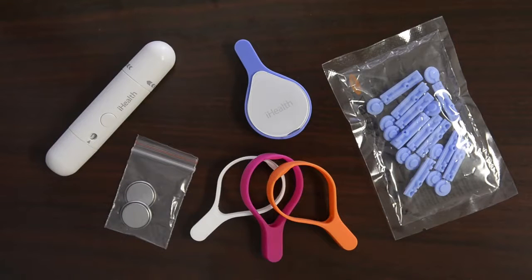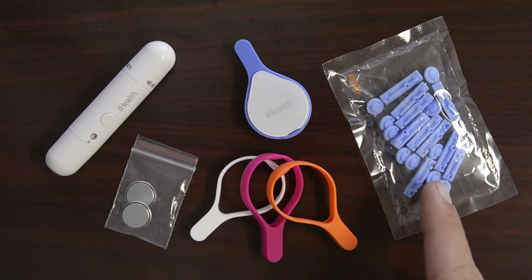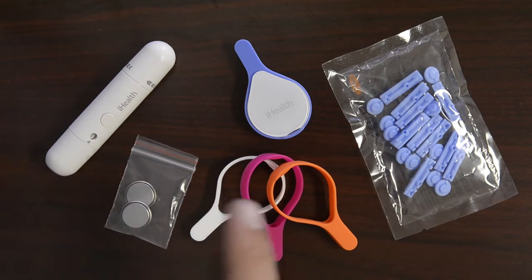Hi, I'm Jim from iHealth and I wanted to walk you through the setup instructions for your new iHealth Align meter. The first thing I want to take you through is what comes in the box. When you open it up, you'll have the meter in its case, a couple batteries, lancets, a lancing device, and extra cases in case your mood varies and you want to try a different color.